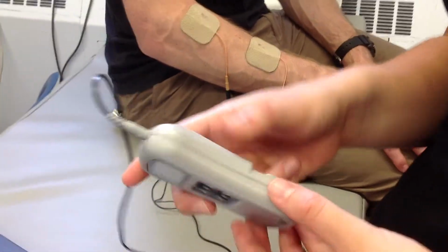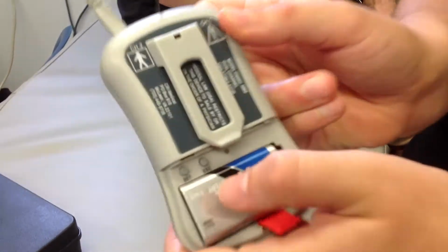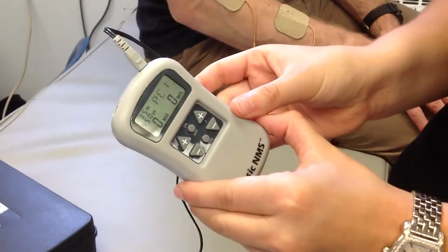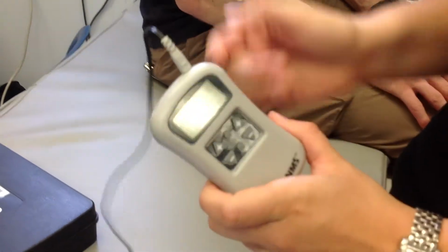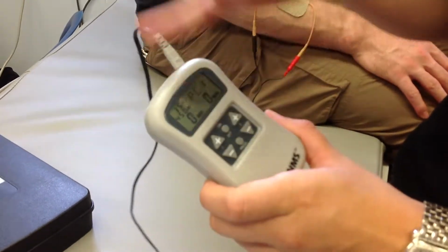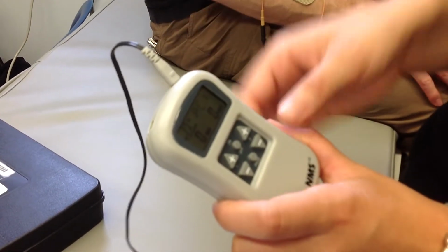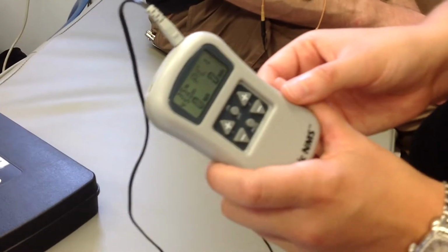Hit the set button in the back in order to change the settings. So hit it once, you get frequency. You could change it up or down with the arrows. Either arrow, doesn't matter.